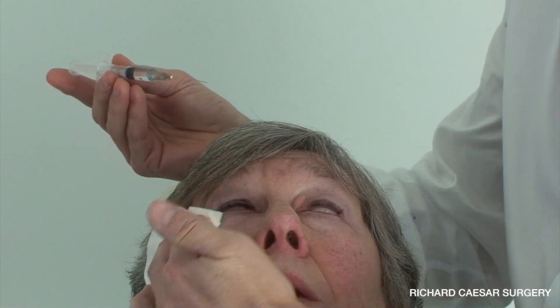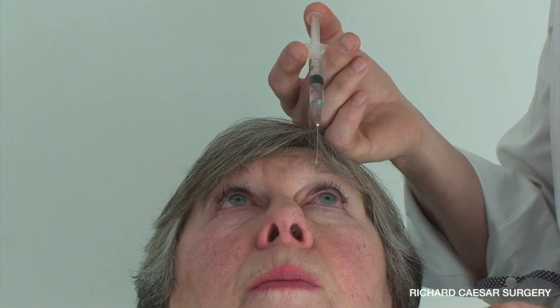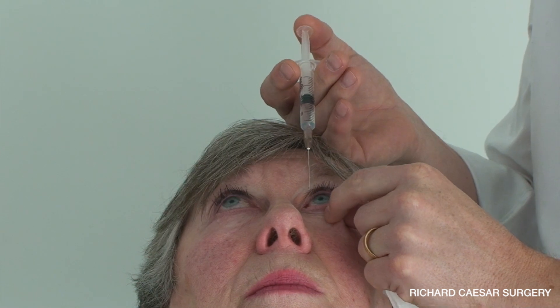For the left eye — and this is the critical part of this — you change your hand position. So originally using your forefinger, now you change your hand position to be using your thumb.